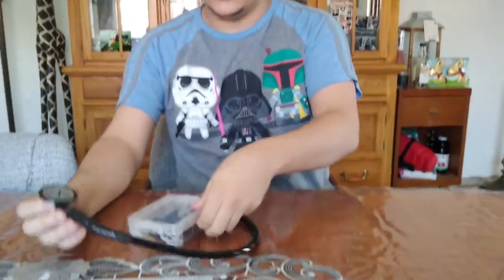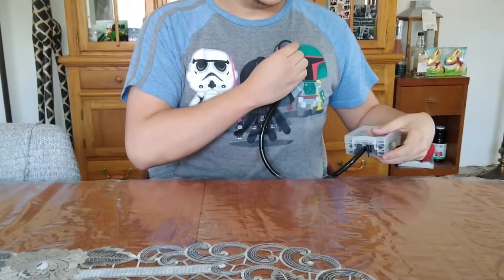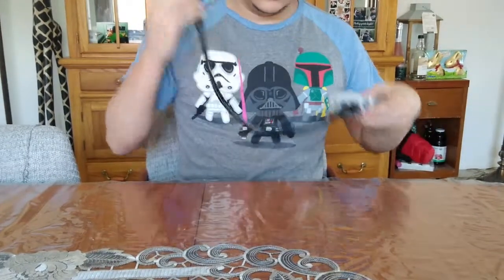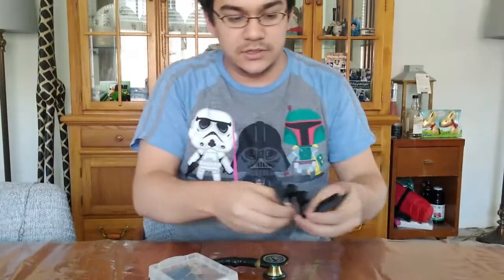And then after that, you just listen in to heart sounds or lung sounds. I am able to hear it. This is our project, the Wireless Bone Conduction Stethoscope.